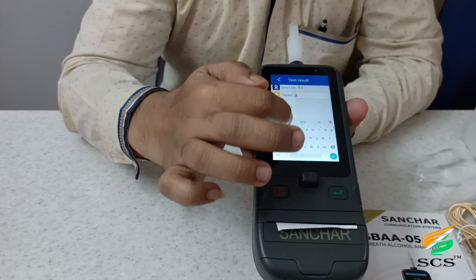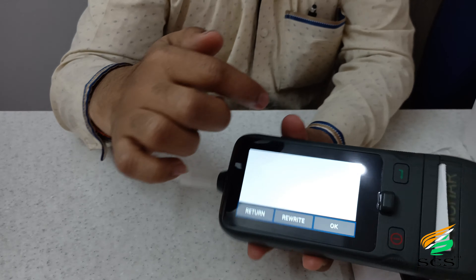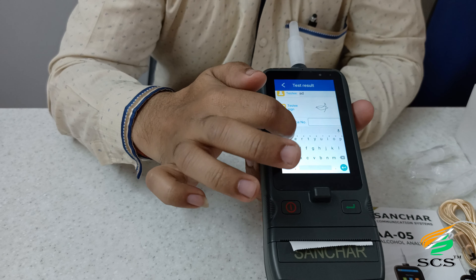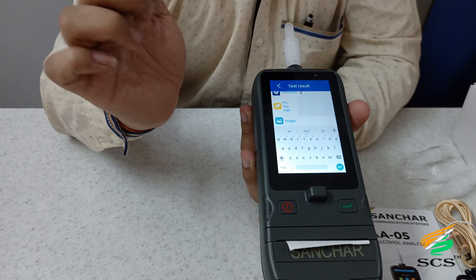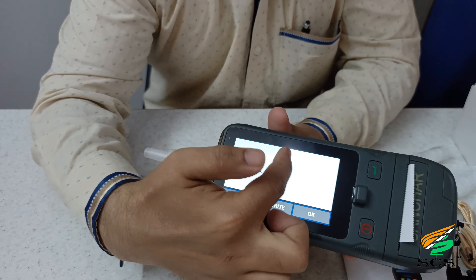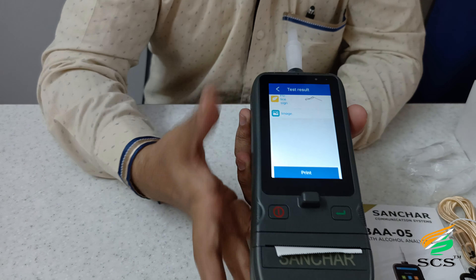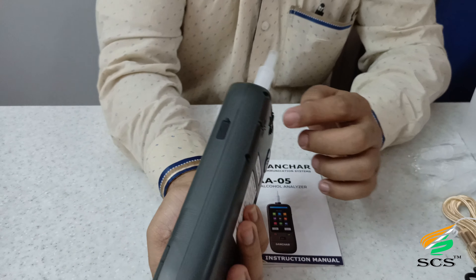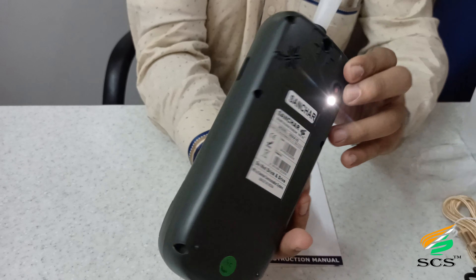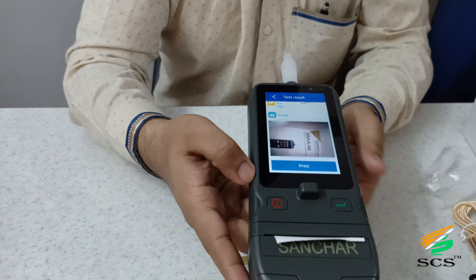This is the duty field — who is being tested. For example, we put a name here. This is the duty signature field; the user can sign here easily and click OK to confirm. Fill in the police ID here. The police officer can sign here; if they want to redo the signature, click rewrite and then OK to confirm. For the image field, click on it — if the user wants to enable the white flashlight, click on it. See the white flashlight activating. Click the capture button to take a picture.